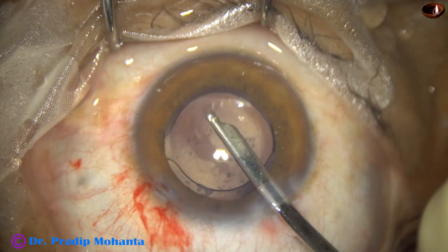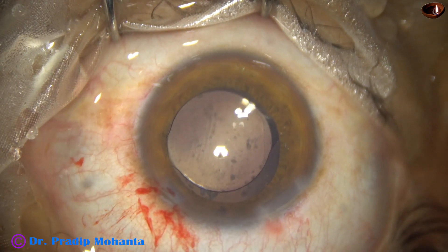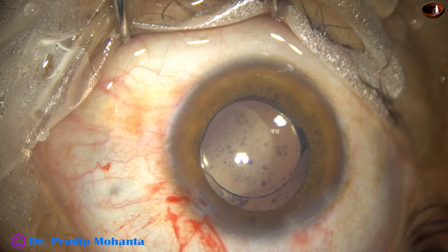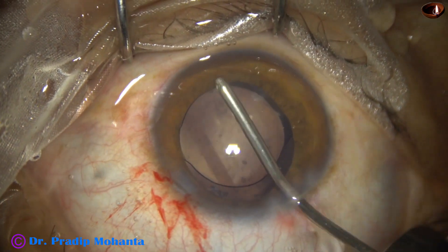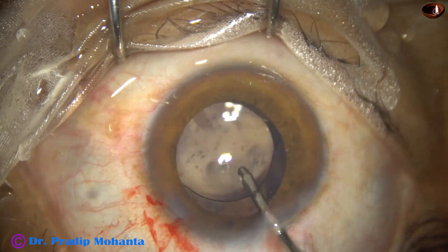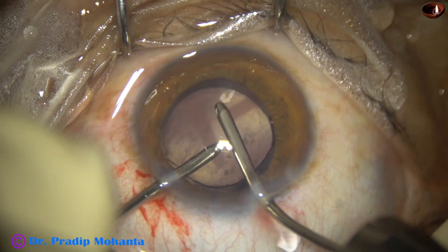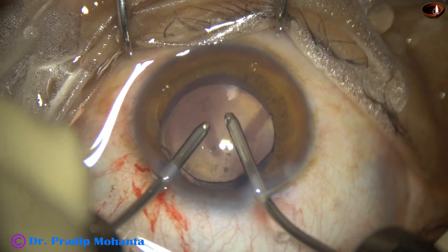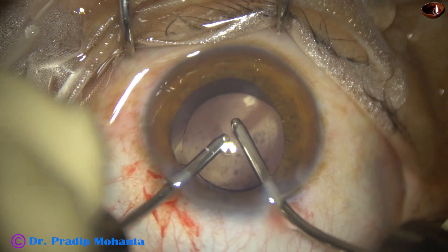In this case we could do optical biometry. There is an option to do optical biometry in silicon oil-filled eyes. If we do ultrasonic biometry, the axial length comes out much more than normal — we have to multiply the axial length obtained by ultrasonic method by 0.71 to get a fairly accurate axial length. If we have optical biometry it is always better. In this case the power of the intraocular lens came as 22 diopters.